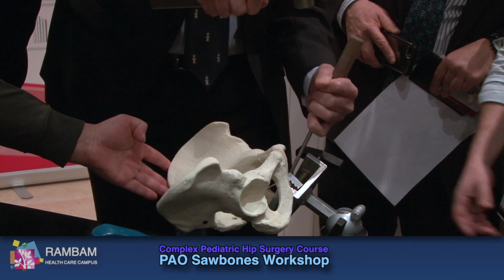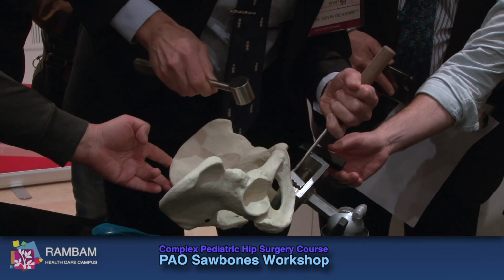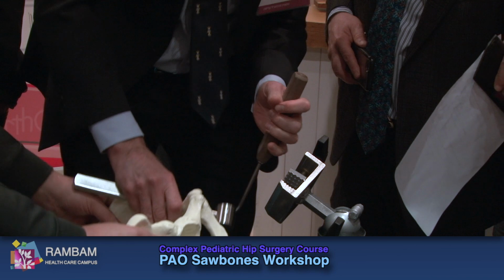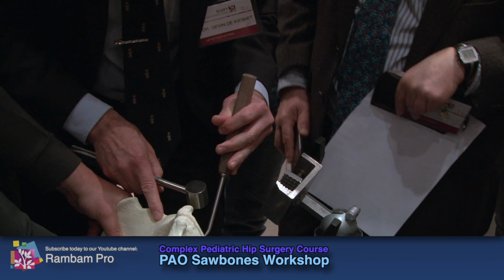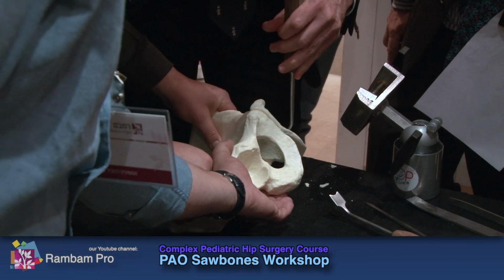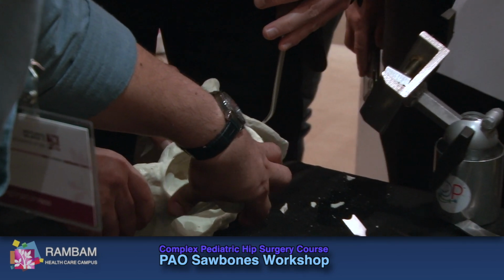I'm doing this. Angle it up towards the spine. Maybe it's better. Aim towards the spine. Hold it. So you are looking to go up there. Up there. You see it's triangular bones. So you want to come out, get it in there, so lateral side. Keep doing this.